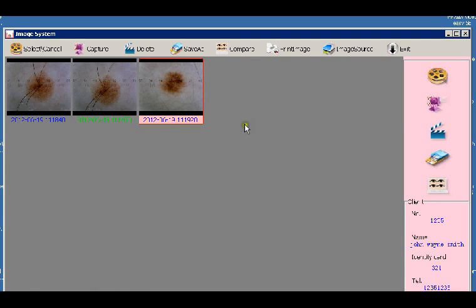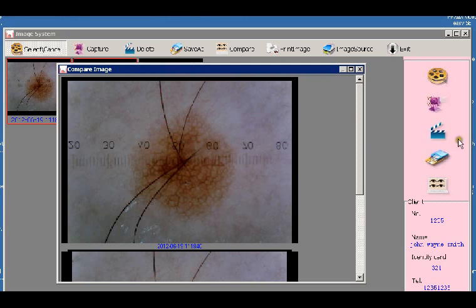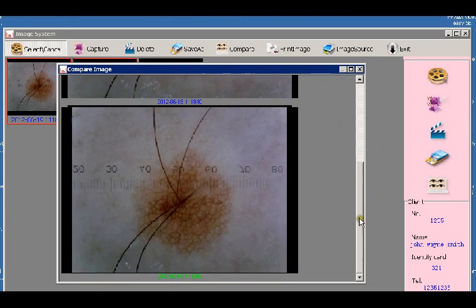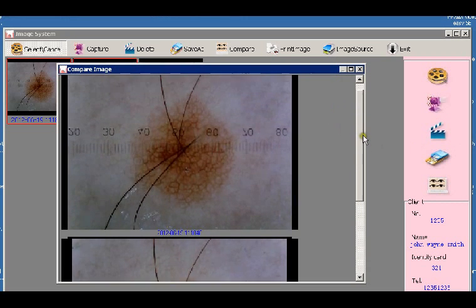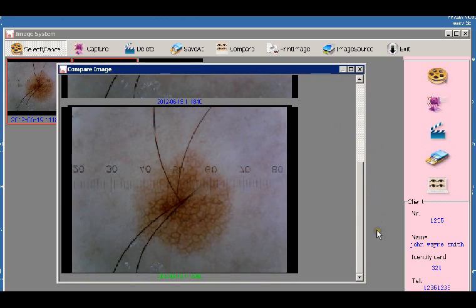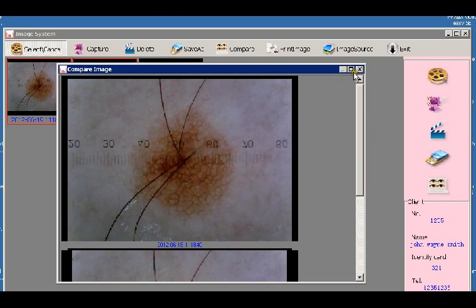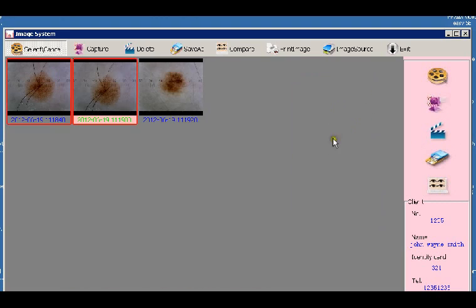And then from here you can do a number of different things. If you select it will show you which ones you're selecting. So you can compare these images. You can compare these images over time for differences in structure, etc. Cancel that.